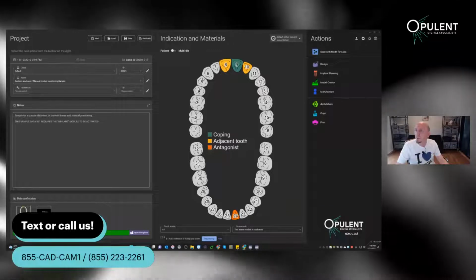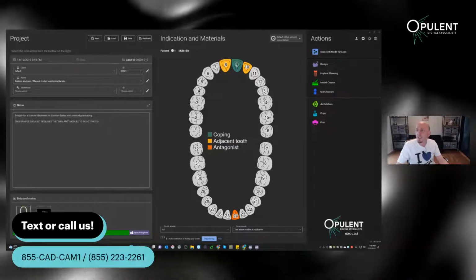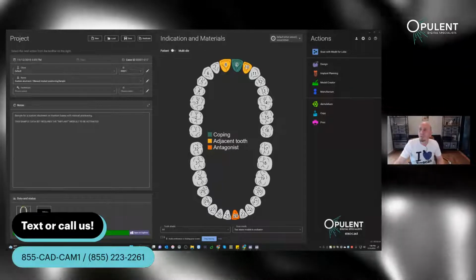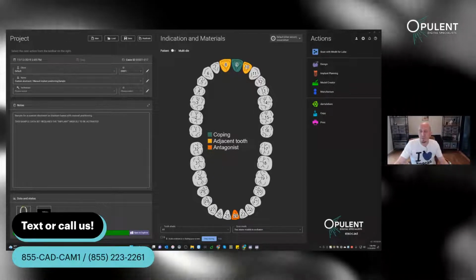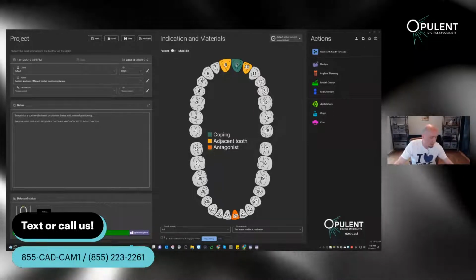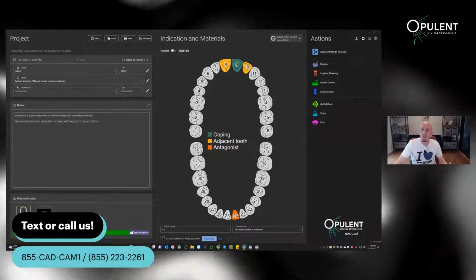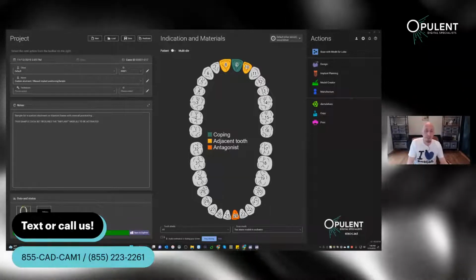There is a question. Hi, Matt. Can you make a stackable guide in Exoplan? Oh, well, you can, but it's a little unofficial, I guess. I also have to play with that quite a bit. I have a couple of friends who I know have already done those, and I want to catch up with some of them. One of them is actually making trainings, and I already reached out. I just haven't heard back from him. I want to partake in his training and see what I can learn.